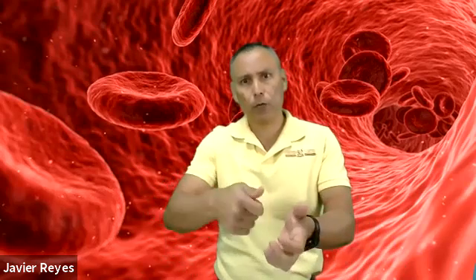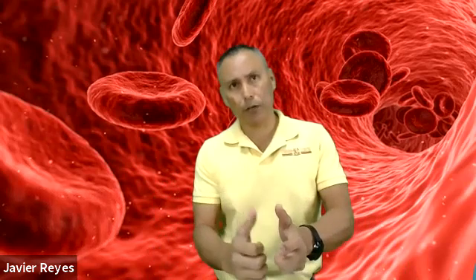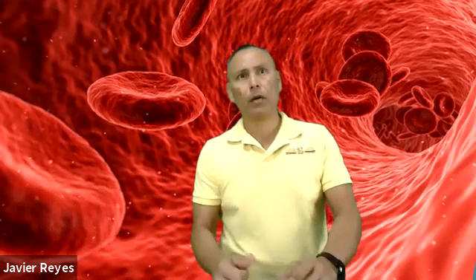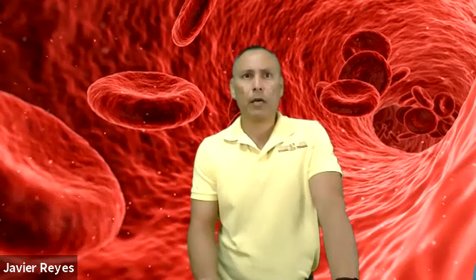The tube position. We talked about inserting the tube into the tube holder. Make sure that when you push it in, you can do a twisting motion so that the tube goes in there. So be very aware of that. If the needle fails to penetrate the stopper, there will be no blood flow. Make sure that you stabilize the tube holder when inserting the tubes. All right, when using the ETS system, very important. Remember to troubleshoot failed venipuncture. The important steps: you always stop, assess the problem, and make the correction.